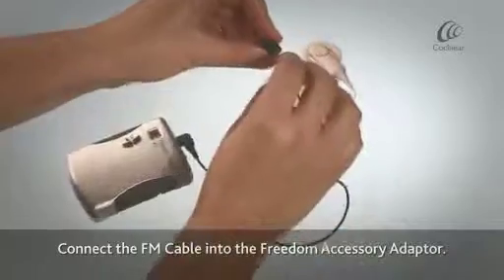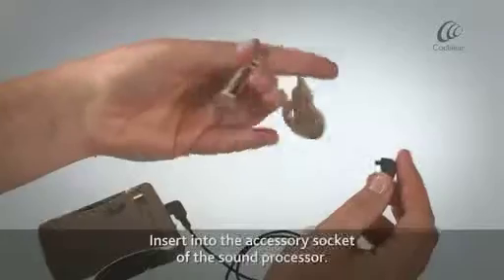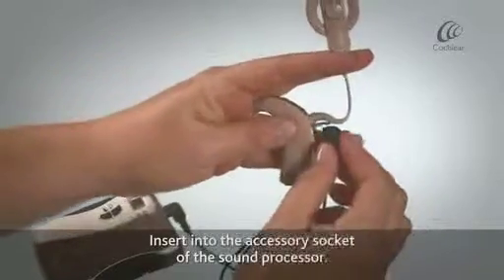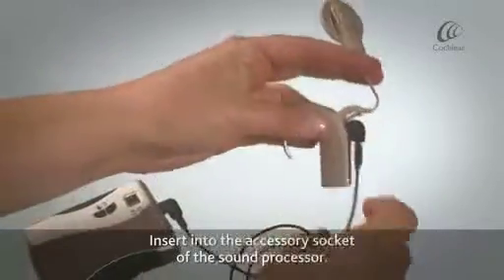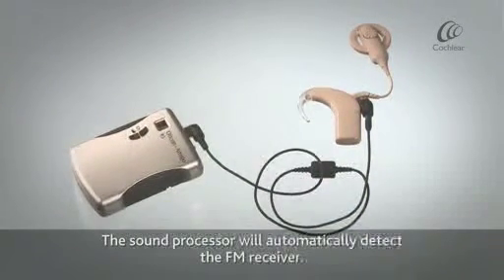Connect the FM cable into the Freedom accessory adapter and insert it into the accessory socket of the sound processor. The sound processor will automatically detect the FM receiver.